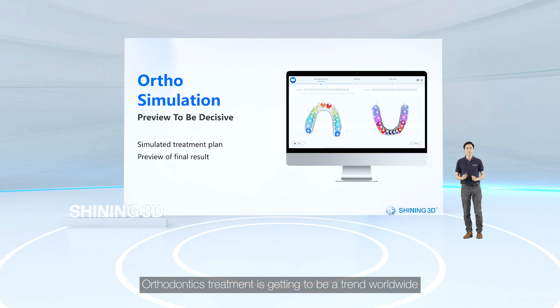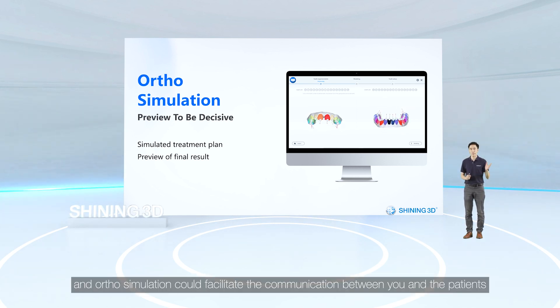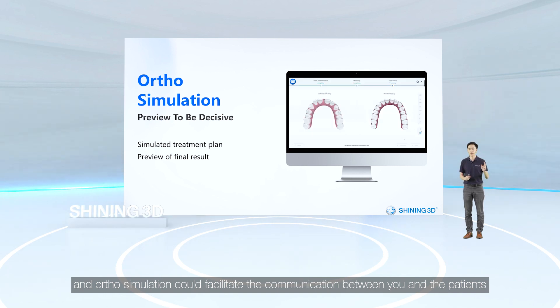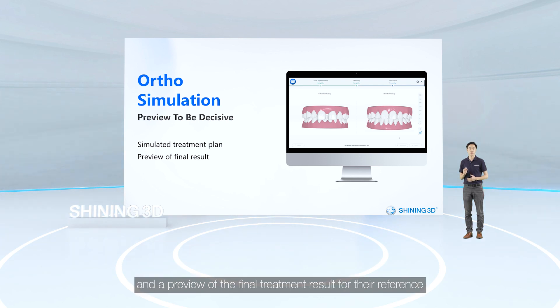We will soon add two new modules: ortho simulation and the oral health report. Orthodontic treatment is becoming a trend worldwide, and ortho simulation could facilitate communication between you and patients by providing a simulated treatment plan and a preview of the final treatment result for their reference.